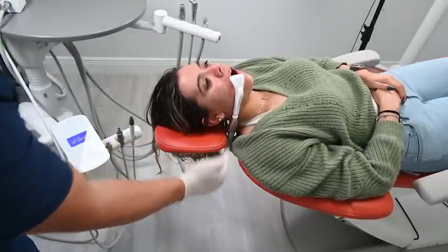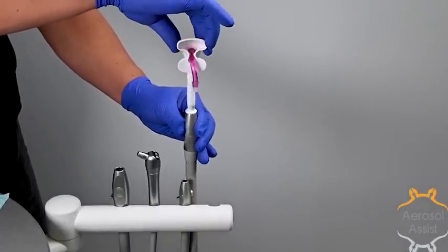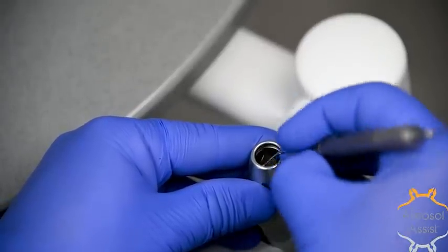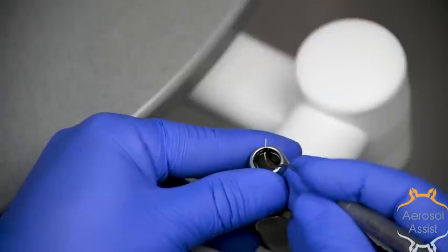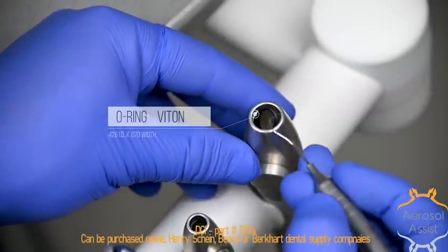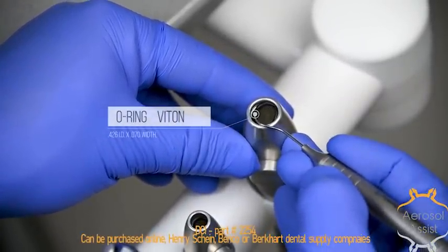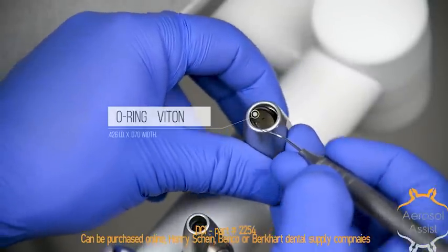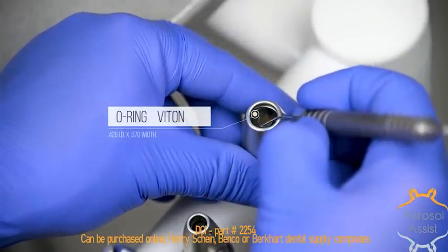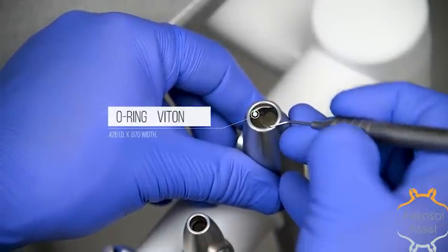The Aerosol Assist is designed to allow for easy rotation while remaining fixed on the HVE. If the Aerosol Assist is loose on the HVE, the O-ring may be worn out or missing. A probe can be used to remove the old O-ring and should be changed every 3 to 4 months or when the Aerosol Assist starts falling off too easily. To install a new O-ring, position the O-ring with a probe so it engages one side of the interior grooves of the HVE, and then twist the HVE so you can view the opposite side and engage the opposite side of the interior groove. Once both sides are engaged, ensure the entire O-ring is fed into the rest of the interior groove.